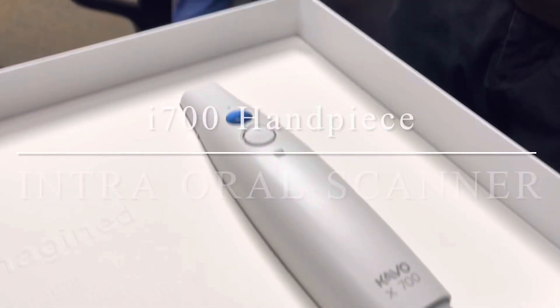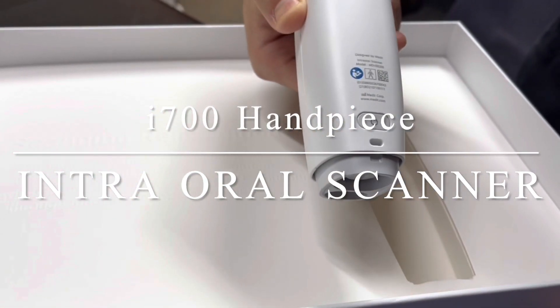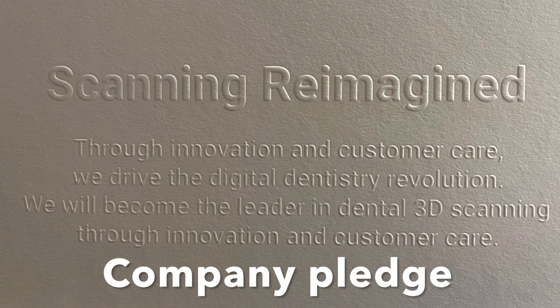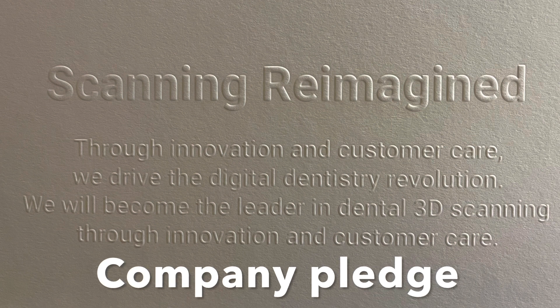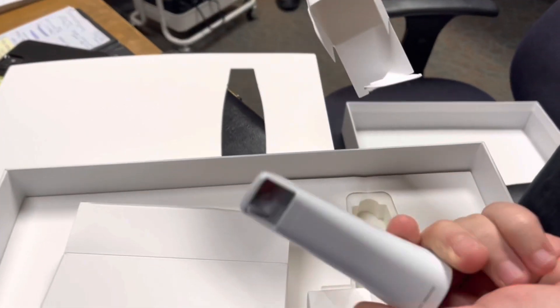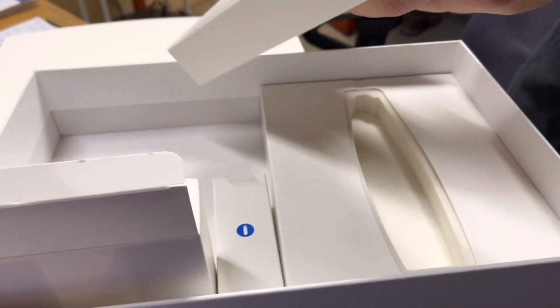We can look inside and there is the scanner — there's the i700 handpiece. You can see how nicely presented it is. I was very excited about the presentation. It shows the i700 and when you look at this piece of pressboard you will see their pledge through innovation and customer care, that they're going to really deliver on this digital dentistry revolution. Inside one of the small boxes is a reusable tip — these reusable tips can be sterilized, which is what patients want. This is important with an intraoral scanner.